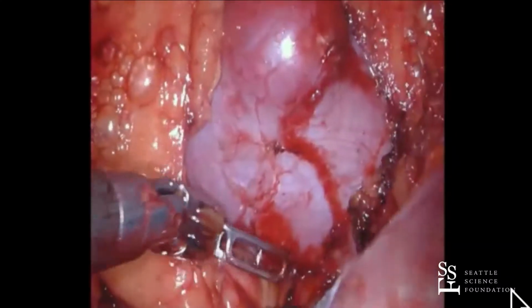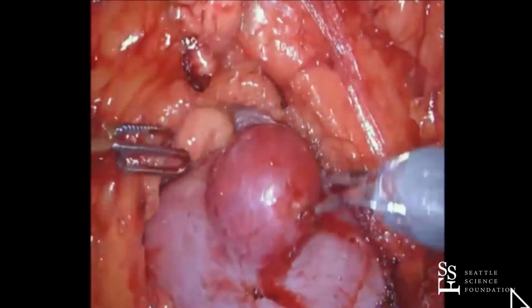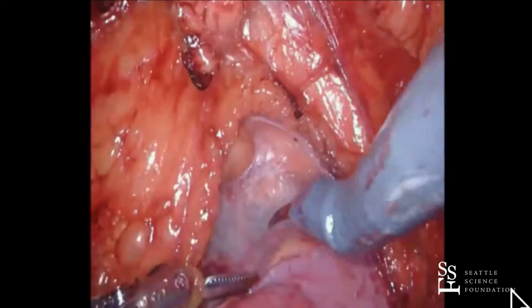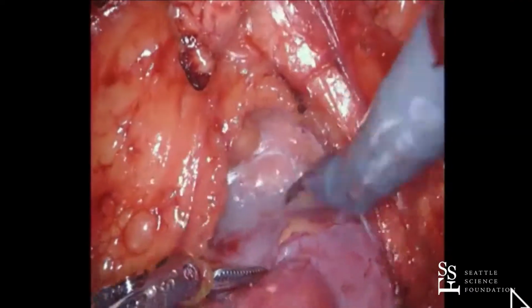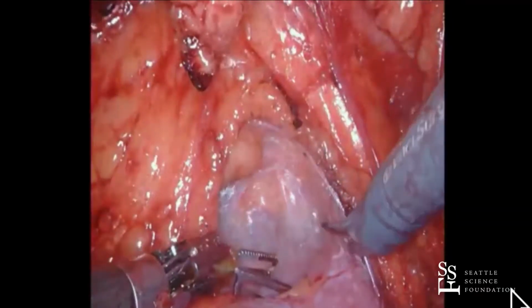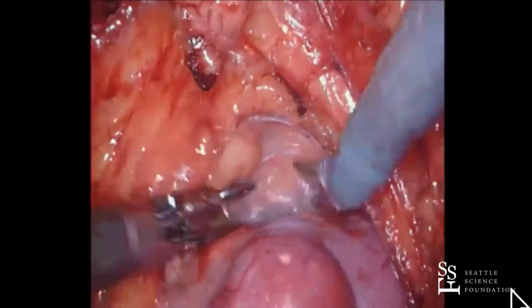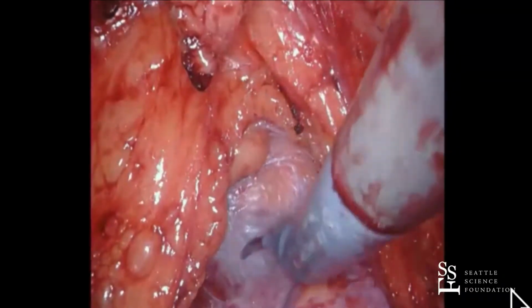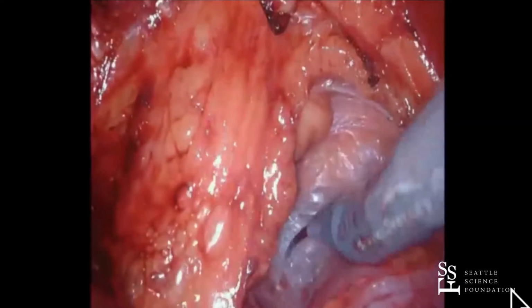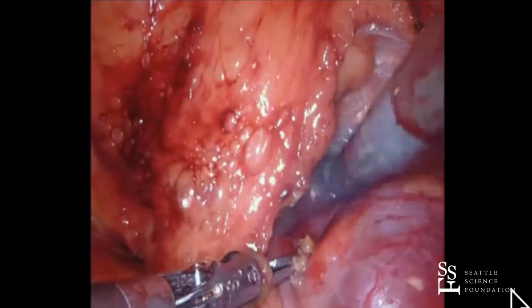So, Jim, do you routinely clean off this much of the kidney, or are you just trying to make it look pretty for us? No, I'm just making sure we can see, and I am going to rotate it a little bit because we need to see this side. This tumor is kind of upper pole lateral. It's not truly posterior. If I could take this tumor out right now, we'd be done. But I'm going to make sure we have good exposure here. I'm going to rotate this tumor a little bit towards me.